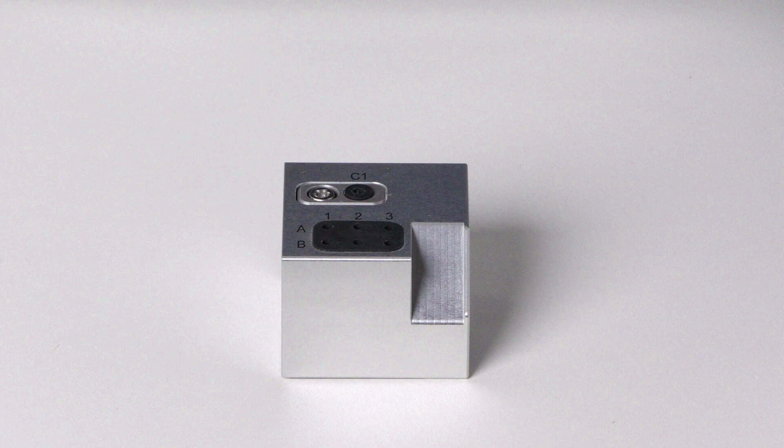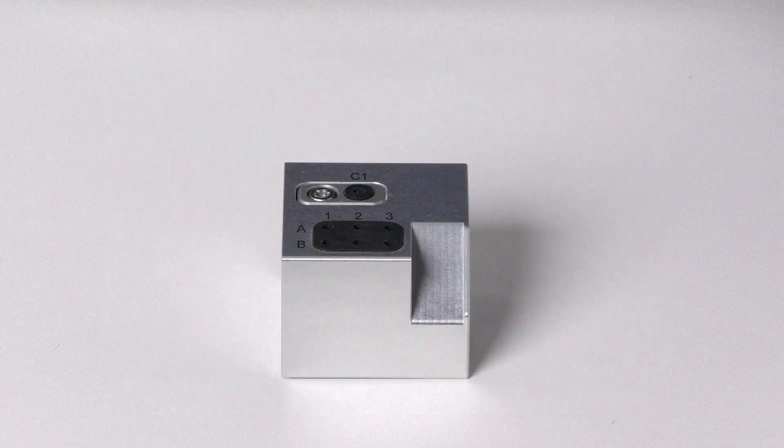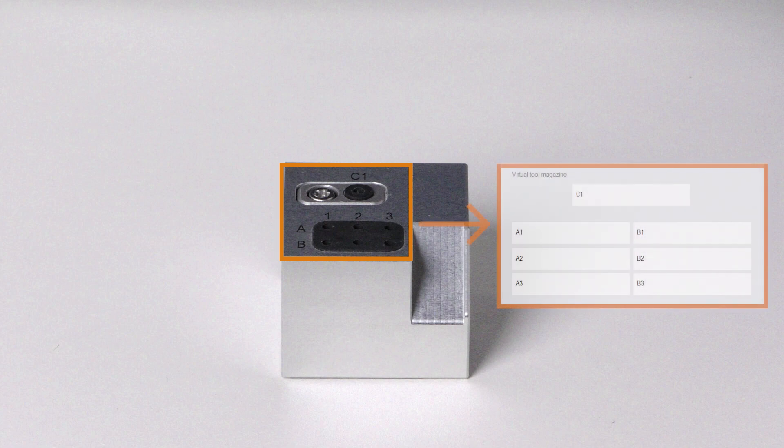Always remove worn or damaged tools from the tool magazine. Dental CNC shows the remaining tool life in the tool administration view. Also make sure that the positions of the tools in the tool magazine correspond to the positions in Dental CNC.